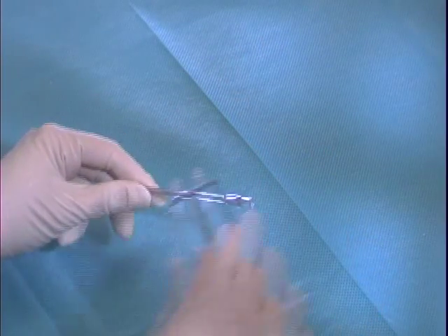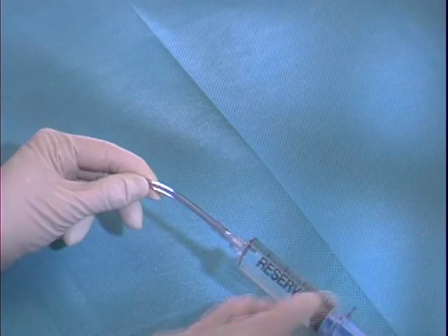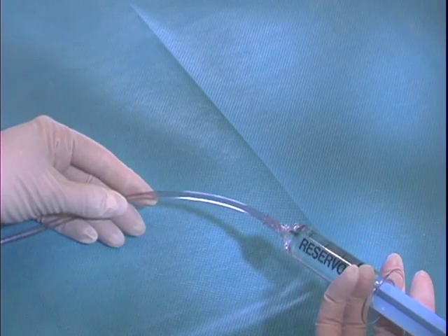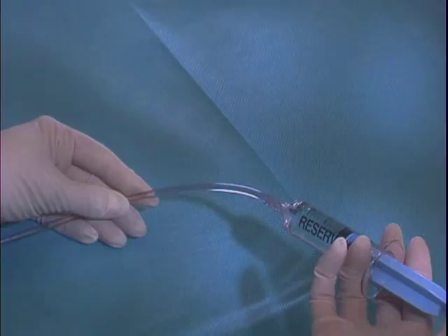If an IV pump is used, the pump must be primed according to the manufacturer's instructions. Tubing sets should also be debubbled and flushed prior to connecting to the Fountain catheter.